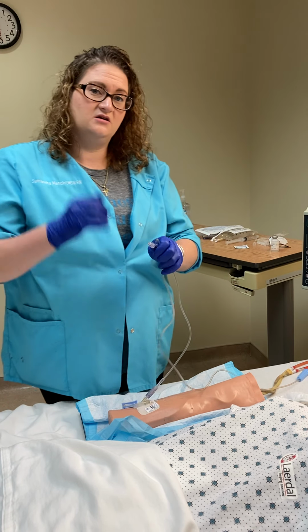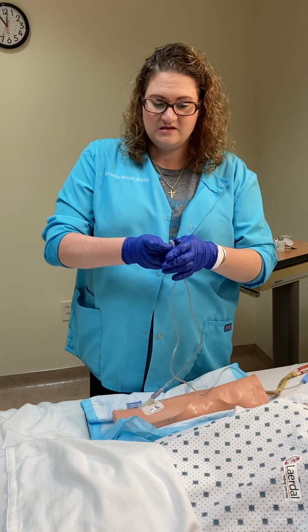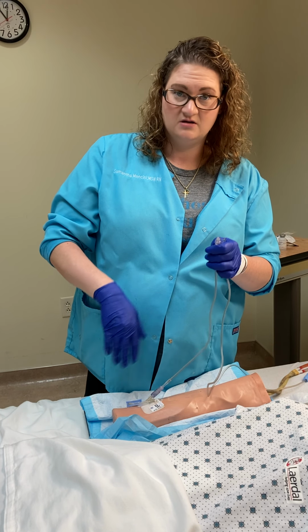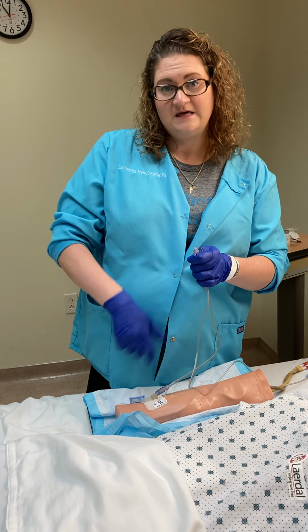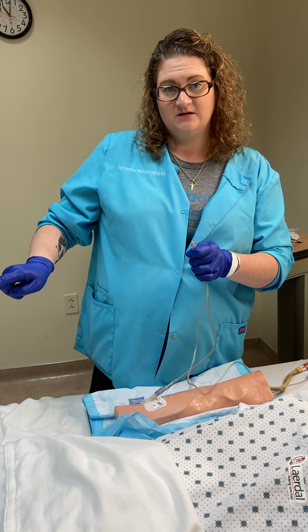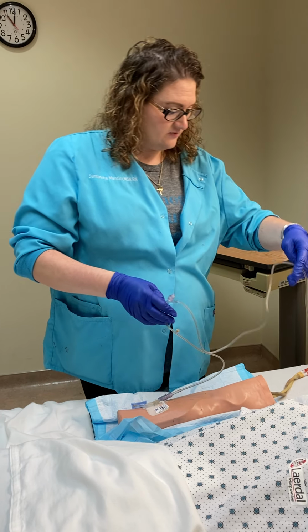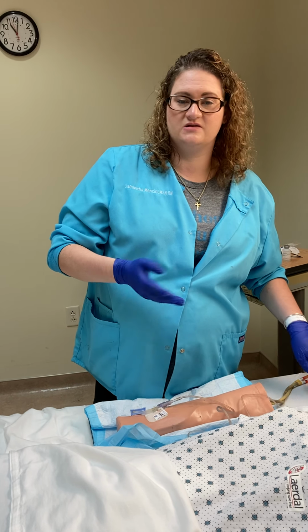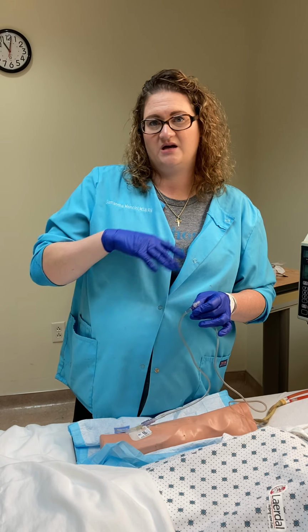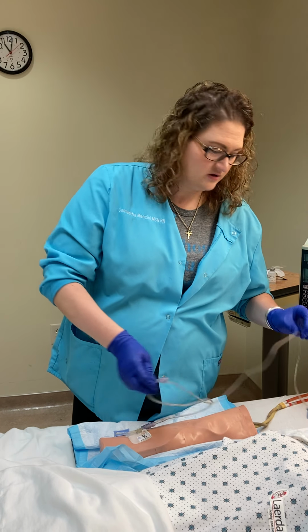If for some reason the medication is not compatible with your fluids, you want to stop your fluids. You're going to flush with normal saline first, then you're going to do your medication, then you're going to flush with an additional saline, and then you could restart your fluids. Or if for some reason maybe the medication is only compatible with dextrose, D5, maybe I do a D5 flush, the med, and then the D5. So that's knowing what your medications are compatible with. Okay.